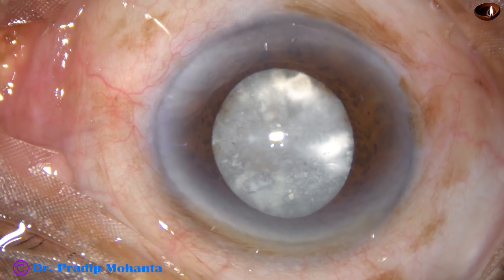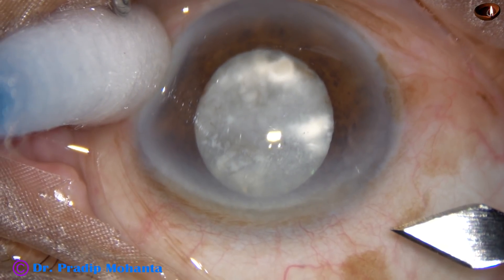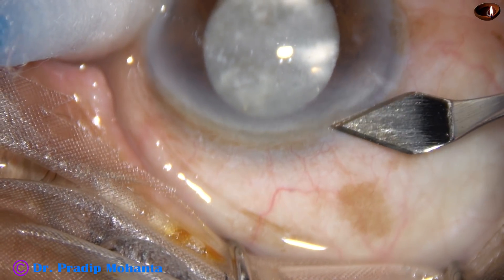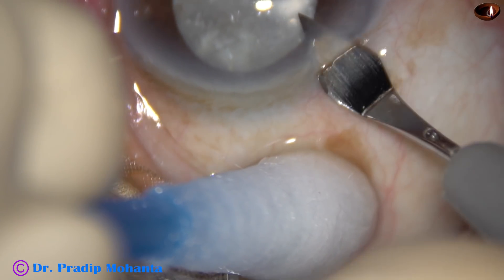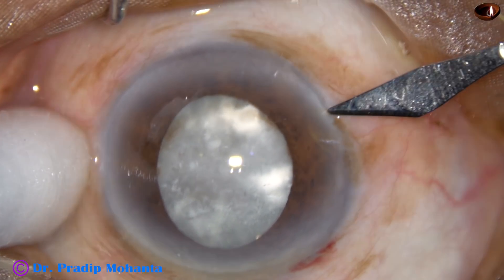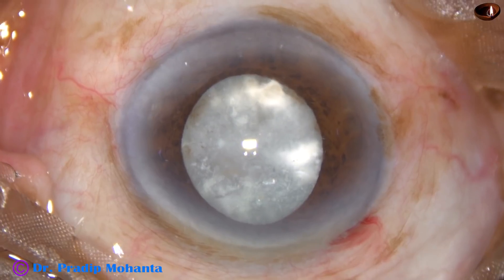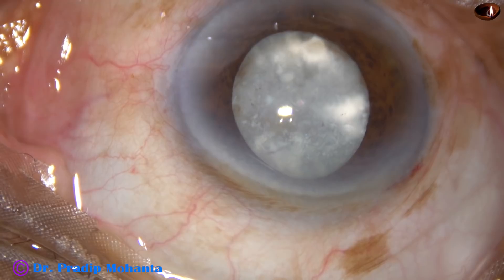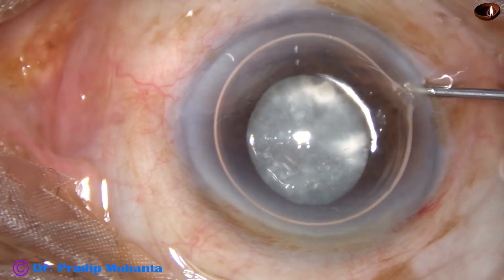This is a hypermature Morgagnian cataract with a lot of changes in the cortex and epinucleus. Just in front of the main incision that I am going to make, you can see some specs that look like diamond specs. So a lot of degenerative changes have occurred in this case. The patient is an 80-year-old lady and she has lost her fellow eye. So this is a one-eyed lady with this kind of cataract, and I am doing phacoemulsification for this eye.